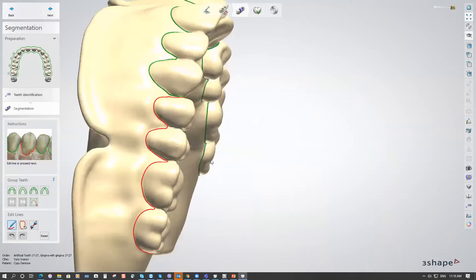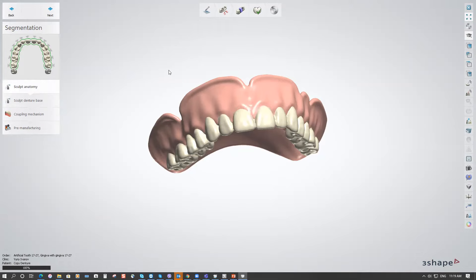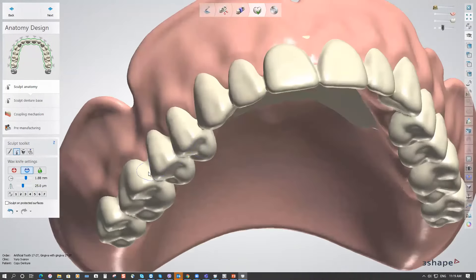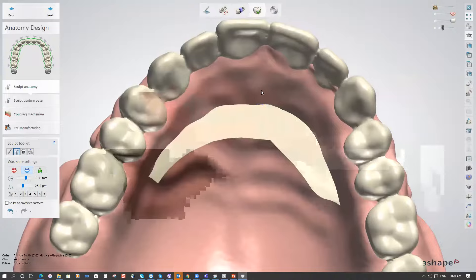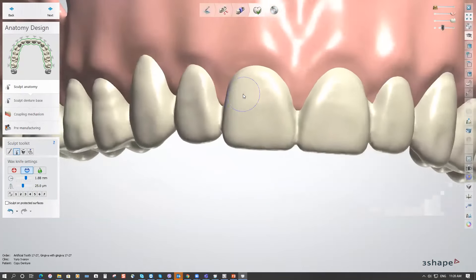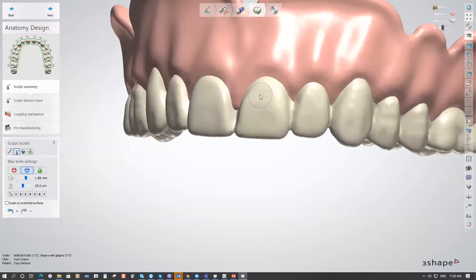You can draw the segmentation line in the position you want. If the line isn't defined correctly by the software, you have the Sculpt Anatomy step with the sculpt toolkit to influence the shape and arch of the teeth. I recommend using the Wax Knife to remove spots on the facial or buccal surface of the denture to make it more aesthetic, and reduce the midline area to make it a bit deeper.